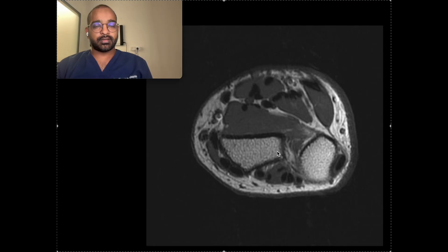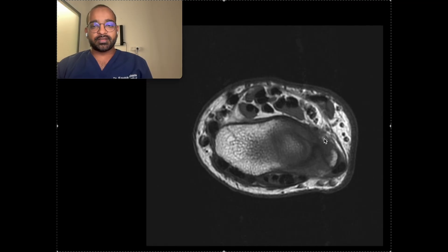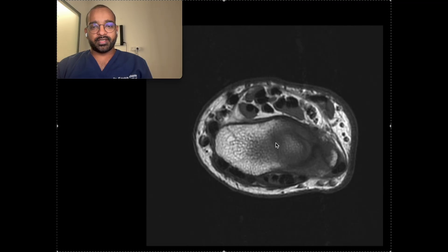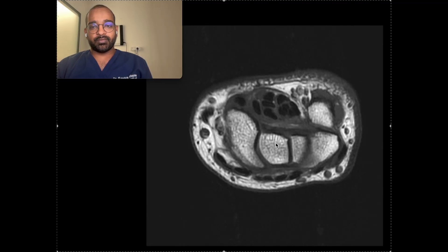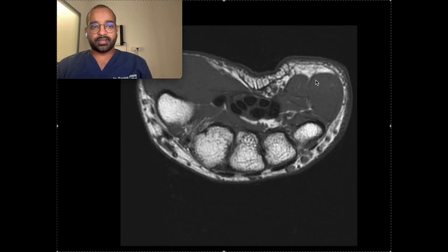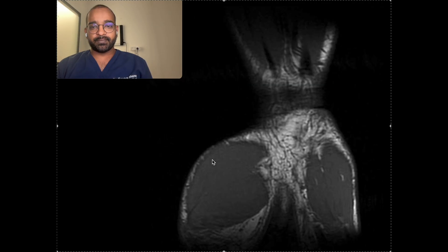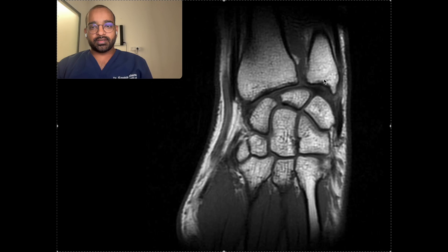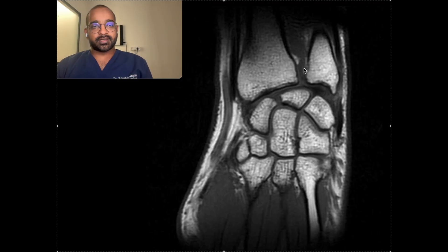Let us see the anatomy of the wrist. Here we can see the axial images of T1, so we see the distal ulna and distal radius, and then the carpal bones. If we go further we can see the metacarpals — these are better appreciated on the coronal images. On the coronal images we can see the carpal bones, the distal ulna, and the distal radio-ulnar joint. This is a complex joint where we have multiple joints.